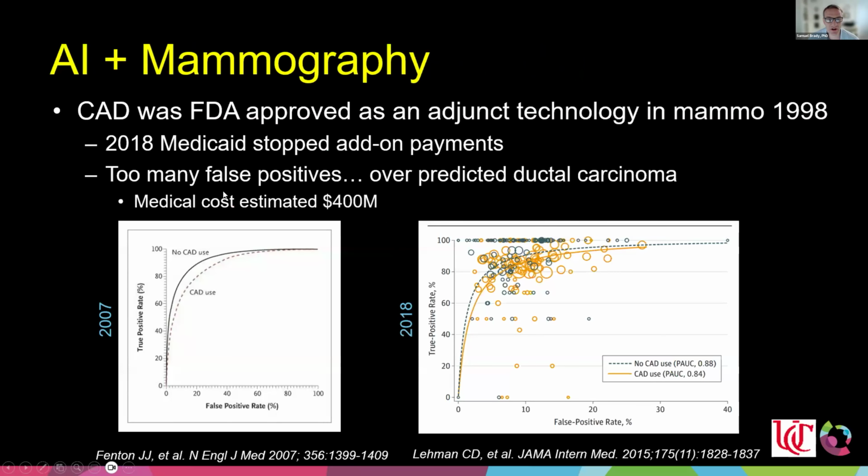And then finally, I just wanted to talk a couple of minutes about where we're going with disease detection. In the US, we have been using CAD technology, which is reader-assisted software to help identify disease in the X-ray-based mammogram. We've been using it since the 1990s.